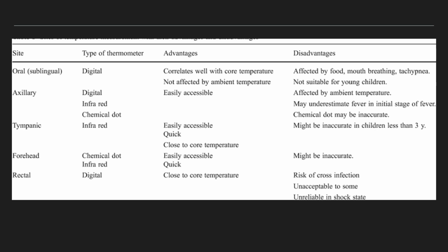Ear. Since the development of the tympanic membrane thermometer, the ear has been added to the list of sites where temperature can be measured easily and safely. Measuring temperature at this site has many advantages. The tympanic membrane receives its blood supply from the same vasculature that supplies the hypothalamus, thus, tympanic temperature readings reflect core body temperature. Cerumen in the ear canal, crying, or otitis media will not alter temperature readings significantly.